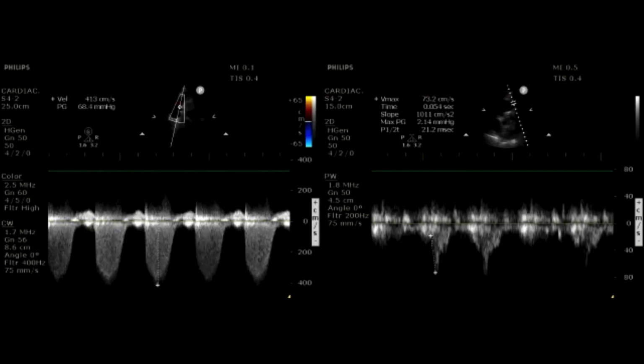We don't see that much of a variation in the TR velocity in patients with pulmonary embolism because it's kind of a fixed obstruction. So you will not see a significant fluctuation in cardiac output, but the cardiac output fluctuation is much more pronounced in patients with bad lung disease, especially in those people that have the more compliant pulmonic arterial circulation. Great, thank you.